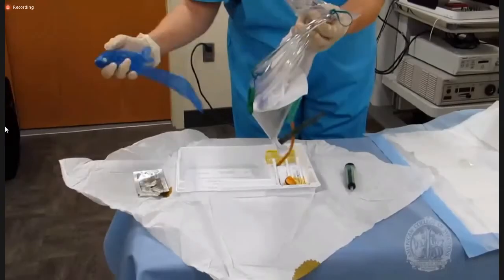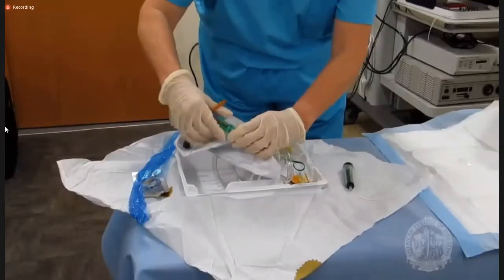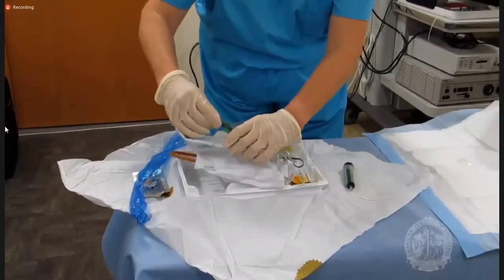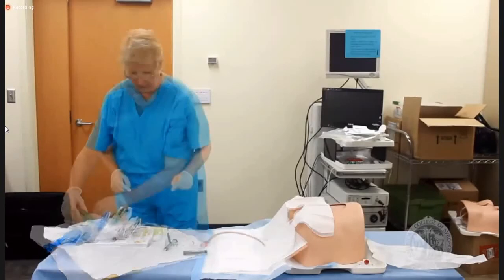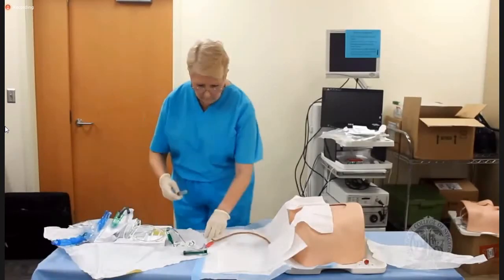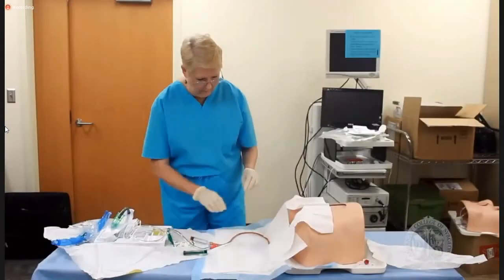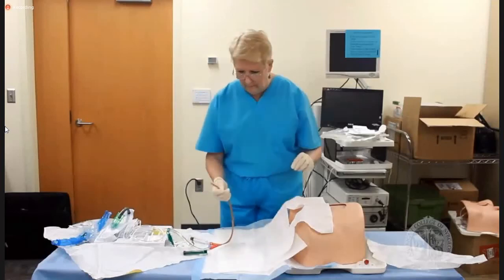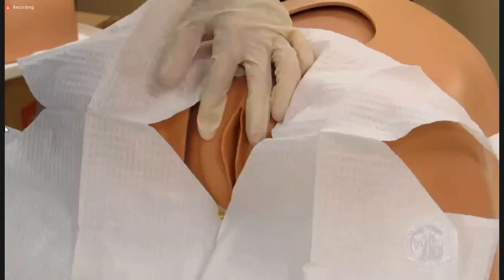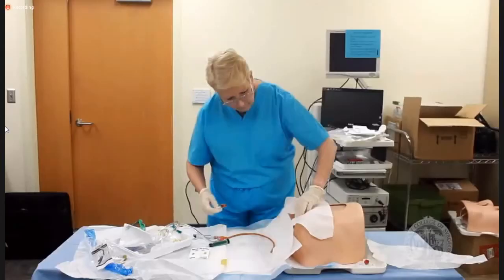Remove any packaging and connect the collection tubing to the catheter. Place the tip of the catheter in the lubricant. Attach the sterile water to the port on the catheter. Though it used to be commonplace to check the balloon, the manufacturer and most institutions no longer recommend this step. You will use your dominant hand to hold and place the catheter. If you're using your left hand to place the catheter, stand on the patient's left side.